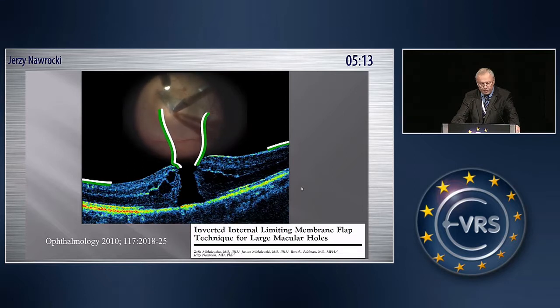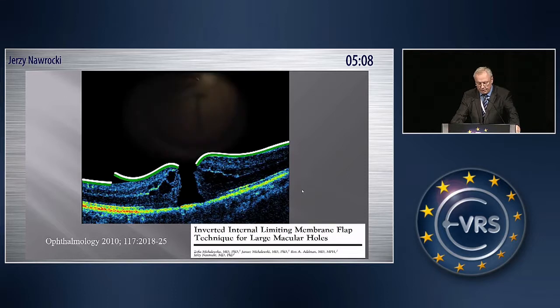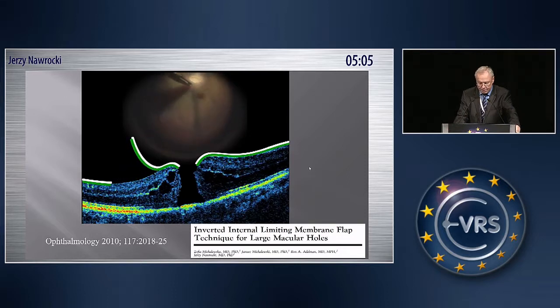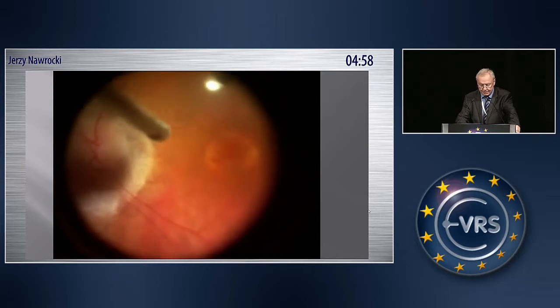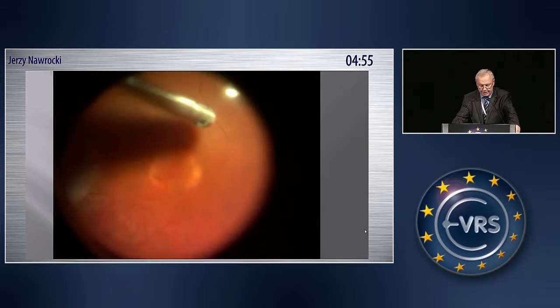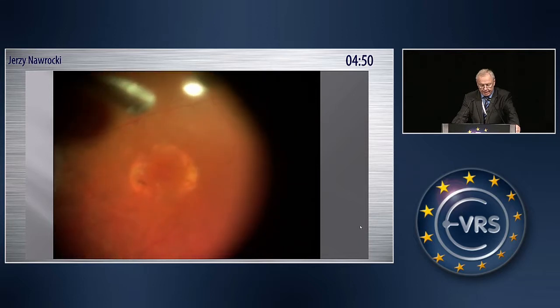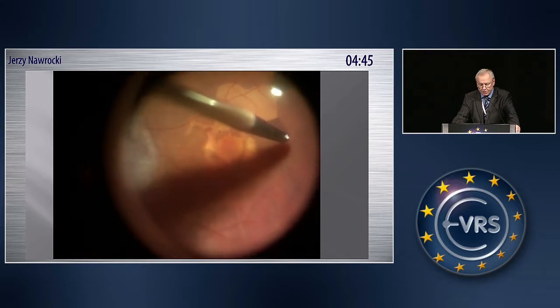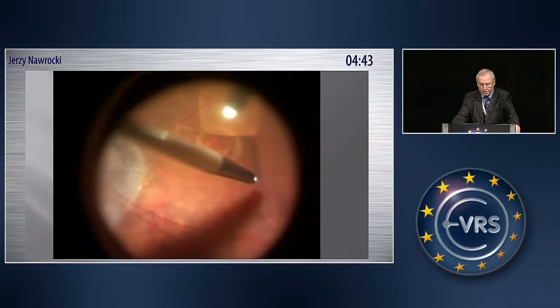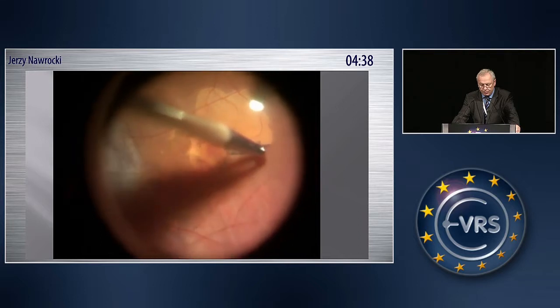Finally, we did a few hundred cases before we decided to present it to the international community, and we published that in 2010, and the technique was performed since 2006. Here you see once again the classical approach, when we stopped trimming the ILM because we found that there is no risk of epiretinal membrane formation in these cases. Here you see ILM is peeled all around the macular hole, but not removed completely.